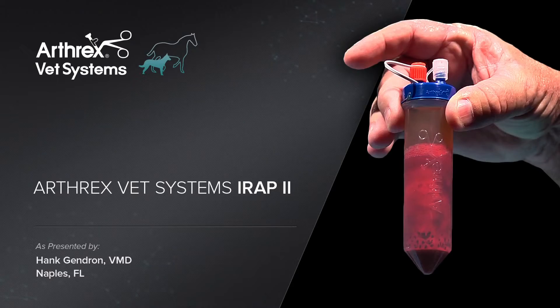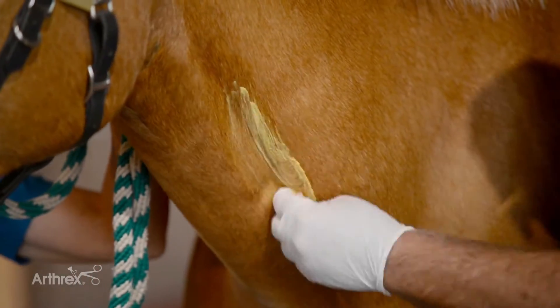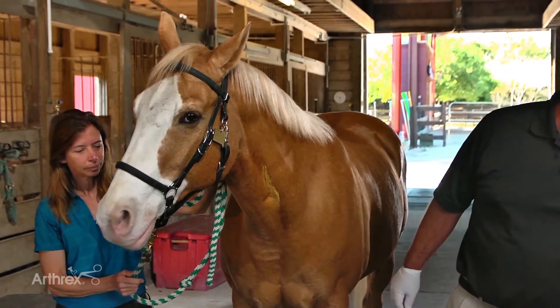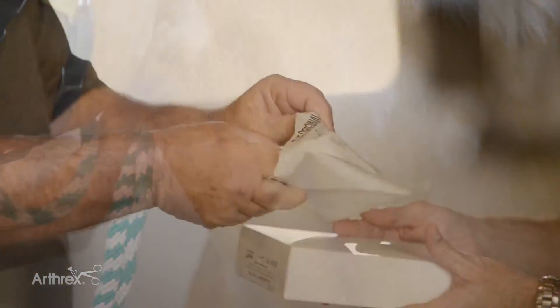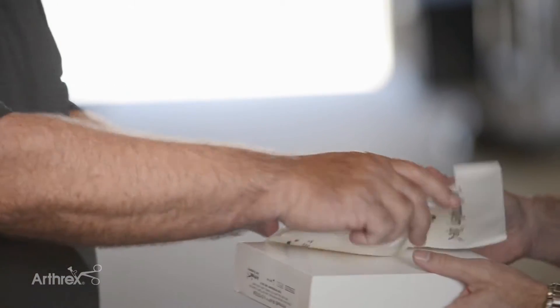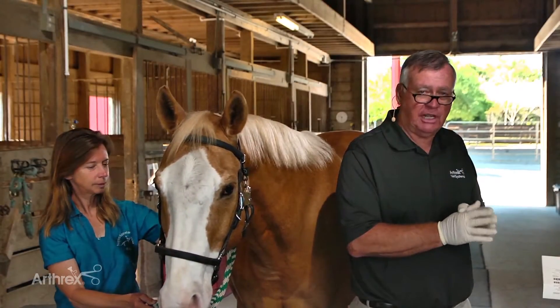Preparing the jugular vein, we like to get the jugular as clean as possible. We do it at least three times with betadine and alcohol so we get a nice clean area for our venipuncture. After preparing the jugular, I go ahead and put sterile gloves on for harvesting the blood. We have to remember we're working with a blood product and we want to be as clean as possible at all times.